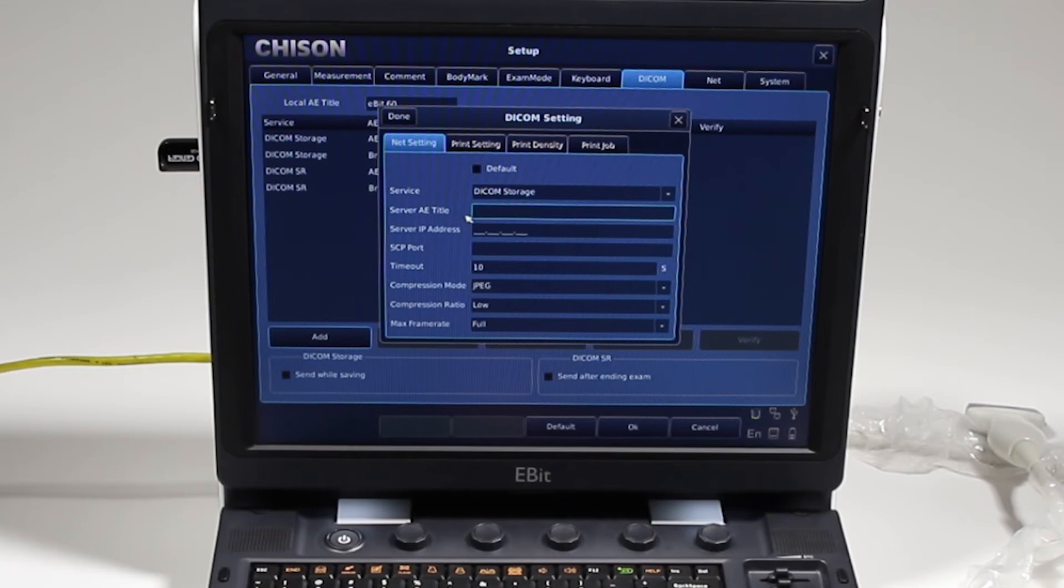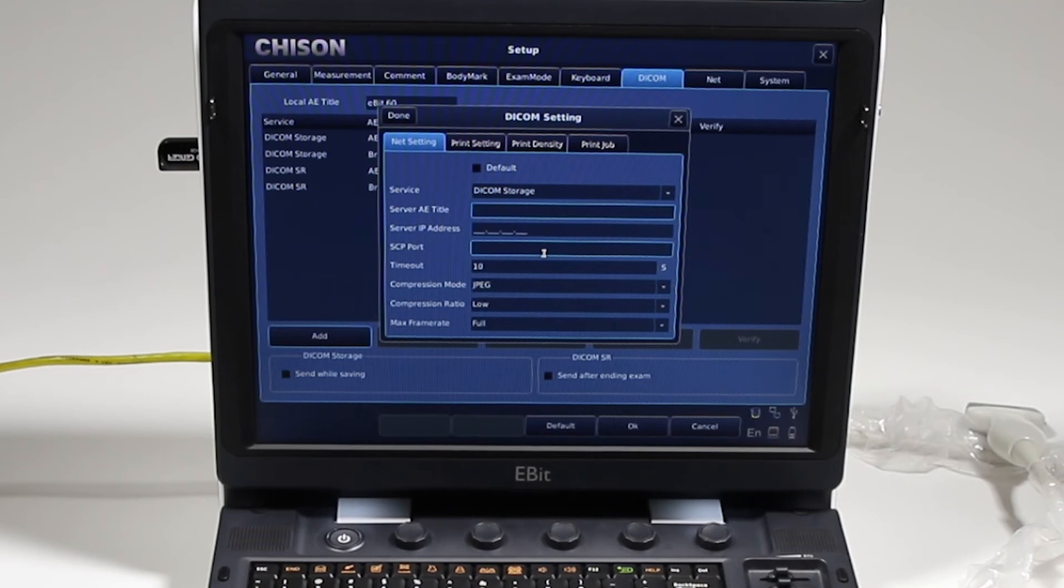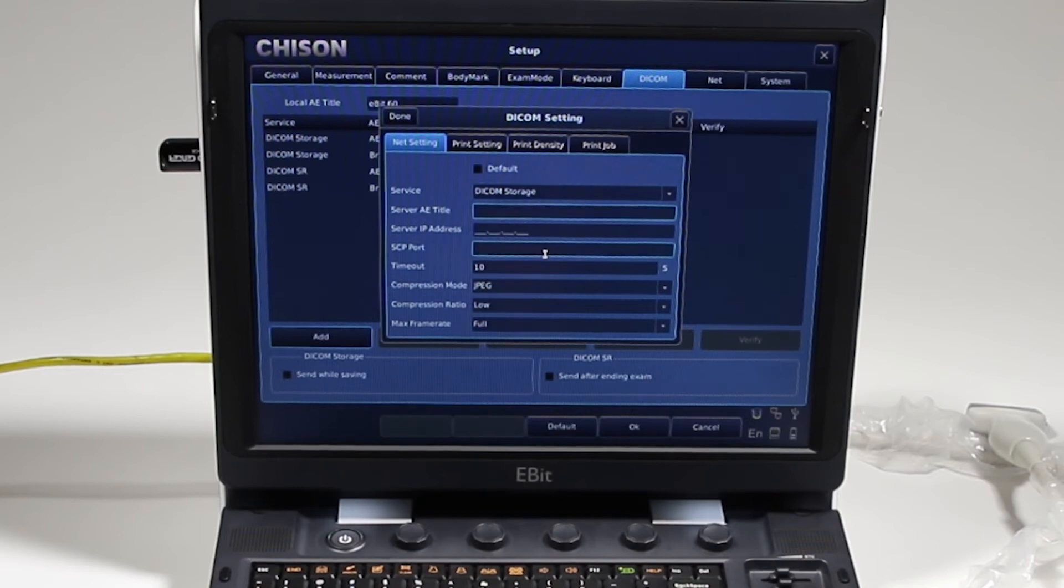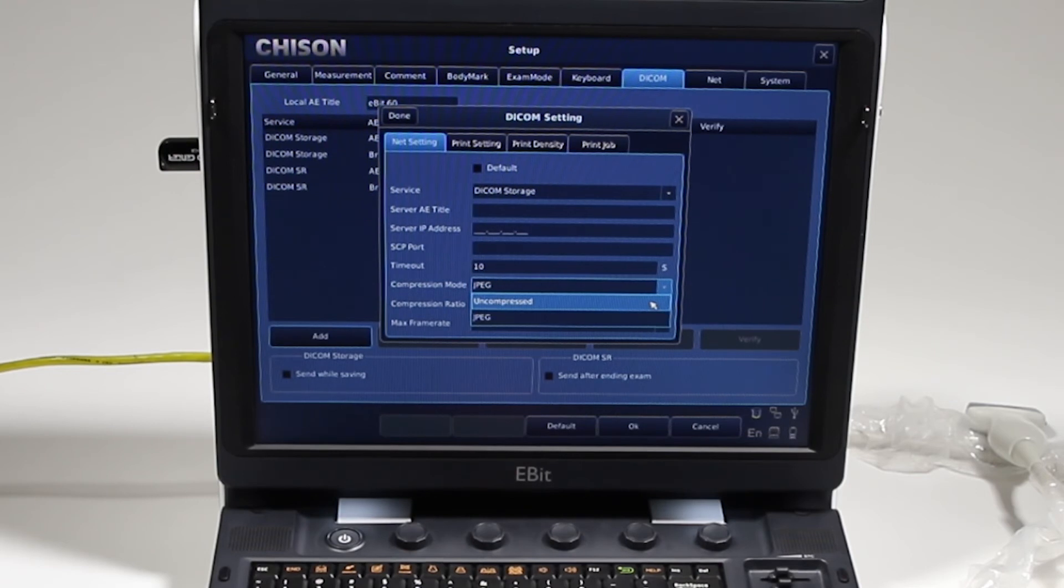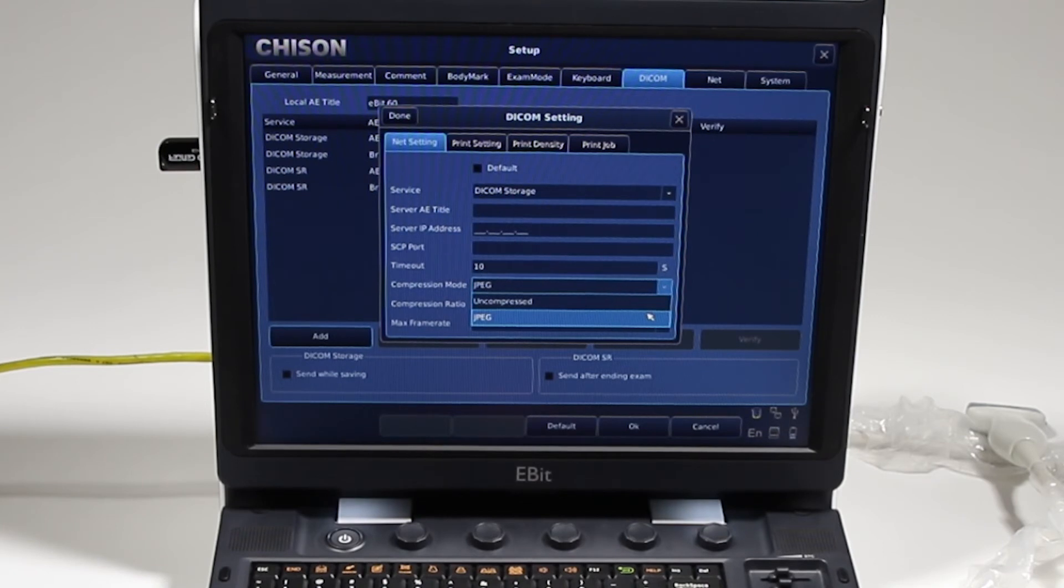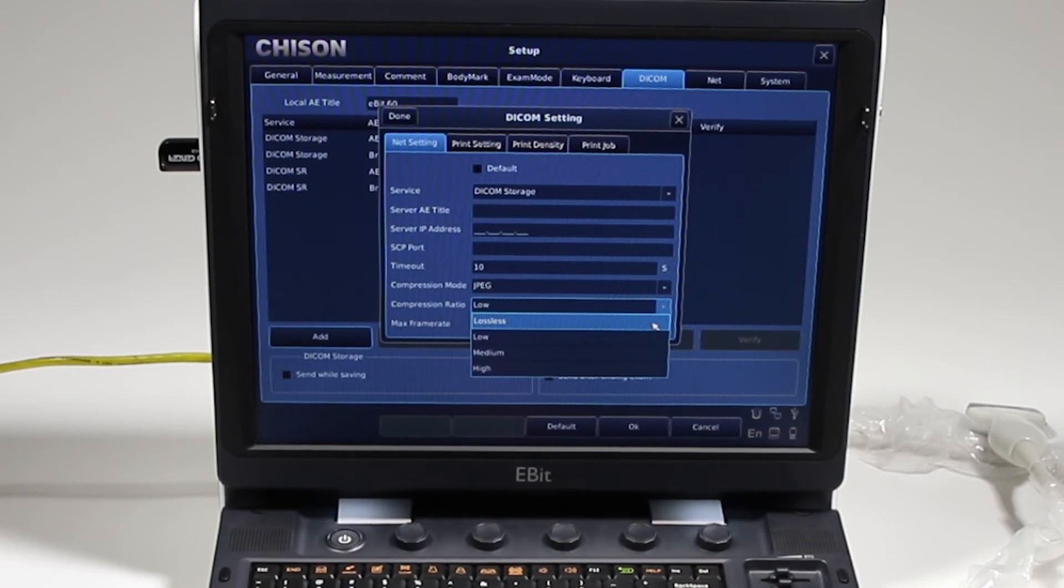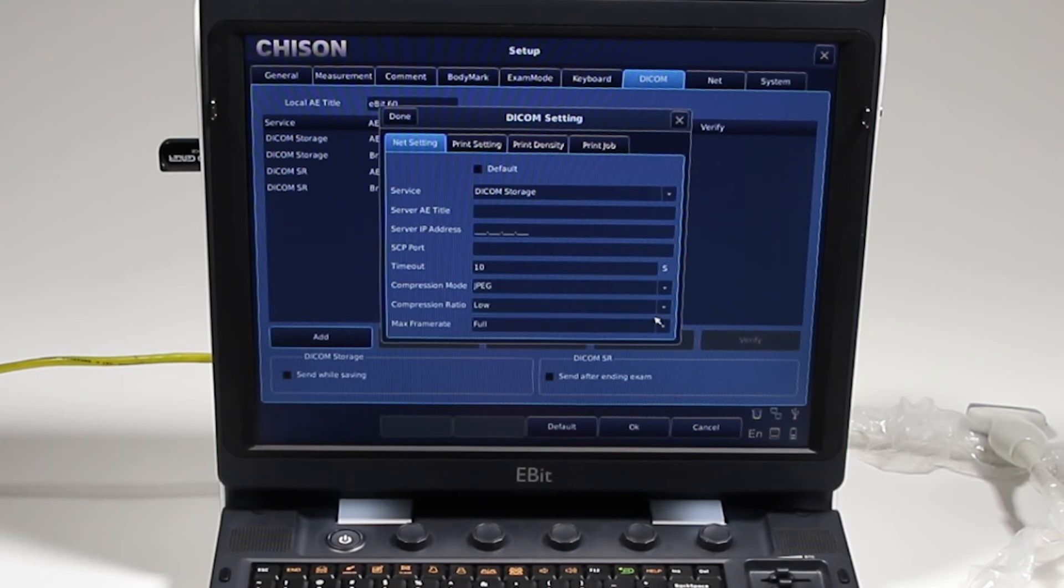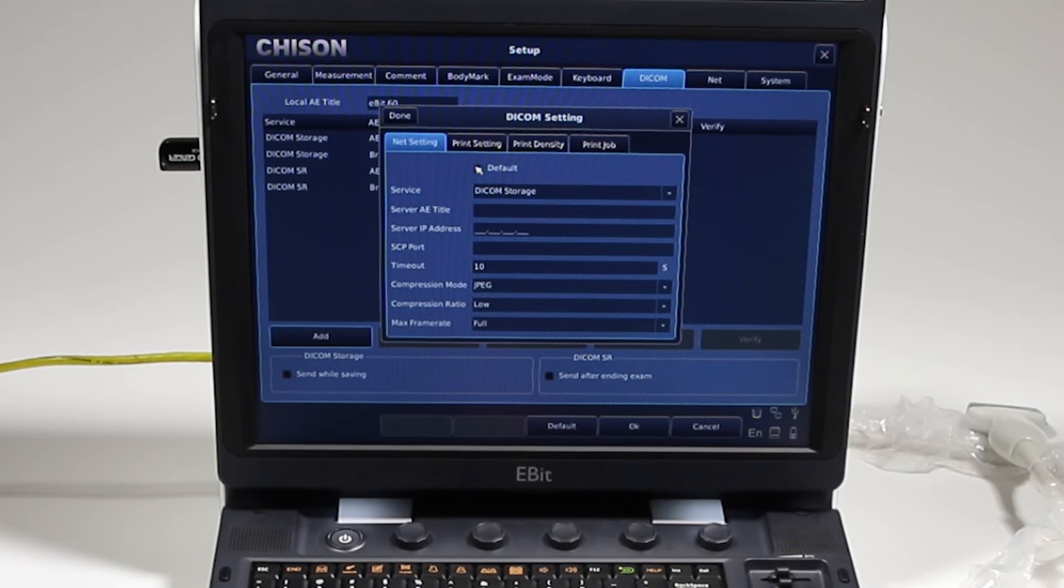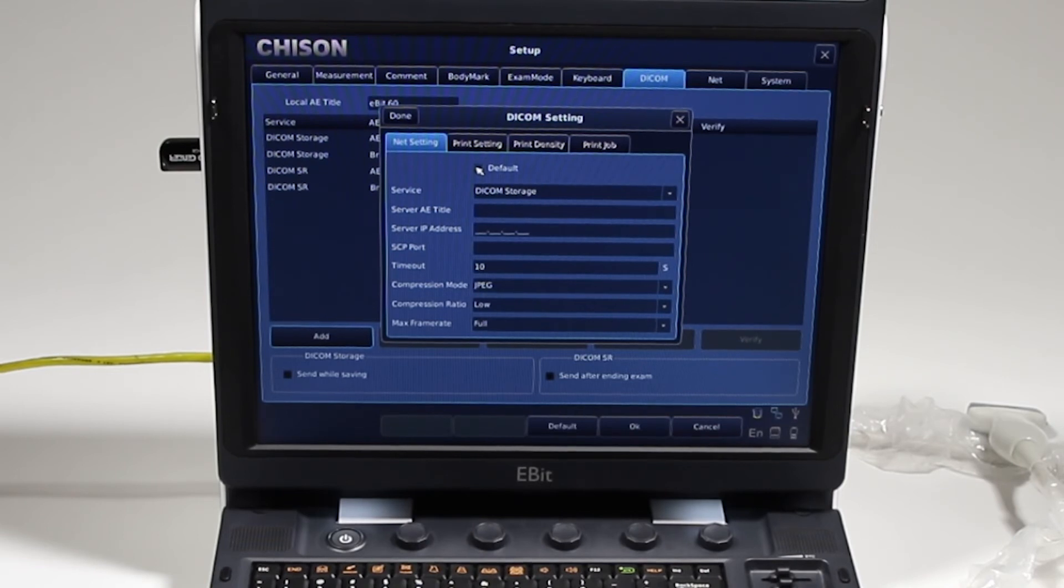And you're going to choose DICOM storage, worklist, structured reports. They're going to give you an AE title, your IP address, SCP port. They're going to give you a port number like 1234, port 104, your IP address. I'm sorry, time out, just leave that at 10 seconds. Compression mode: this is important. If it's uncompressed, it's going to be a very large file and it'll take a very long time to transfer over a network. Typically you're going to want JPEG with a low compression. You can choose lossless too, it's just going to be a larger file. But a low compression is still a very good image and very few can actually tell the difference. Leave the max frame rate at full unless it's not that important to you. And here's where you're going to check default. If you check default, when you go ahead and send that DICOM storage, it's going to automatically send to this one.